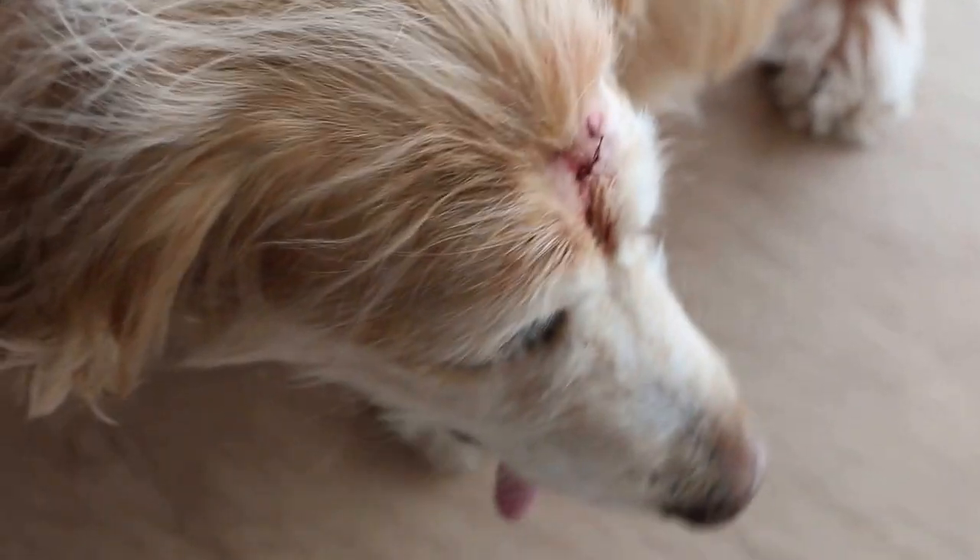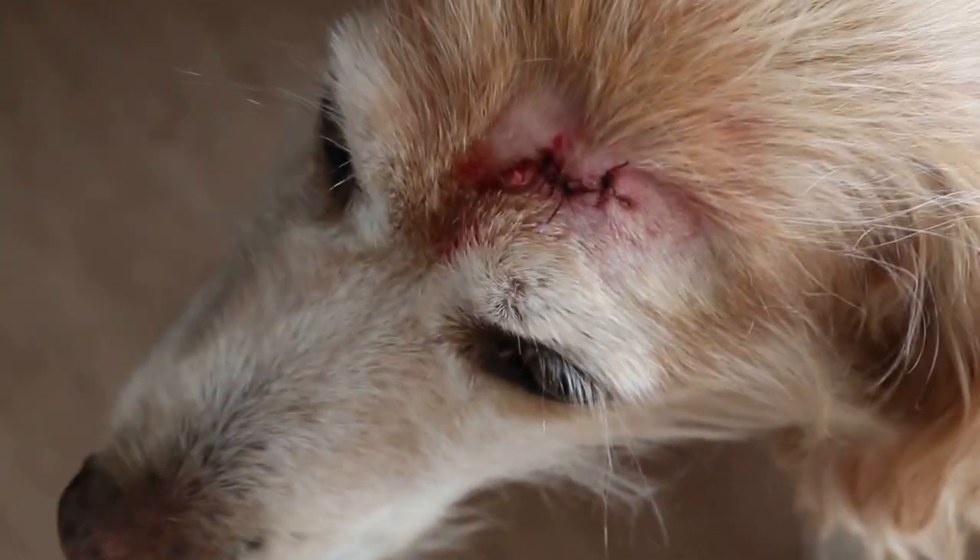We just finished removing the wart. Hold tight — there was some bleeding but we ligated the blood vessel now.